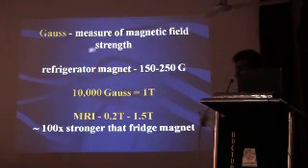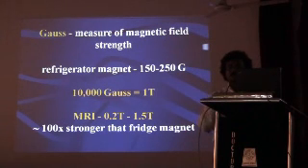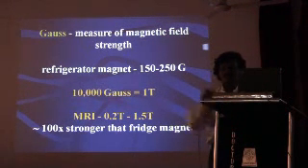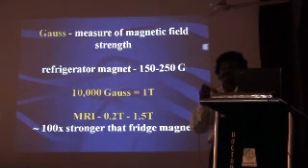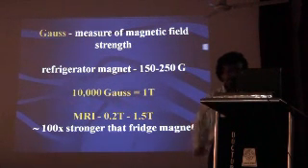Naturally, the MR machines available are 0.2 Tesla to 1.5 Tesla, but in Calcutta 3 Tesla machines are also available, at least in 2 centers. And in the laboratory, we have produced a magnet of up to 30 Tesla till date.